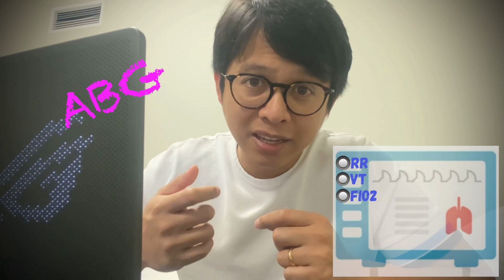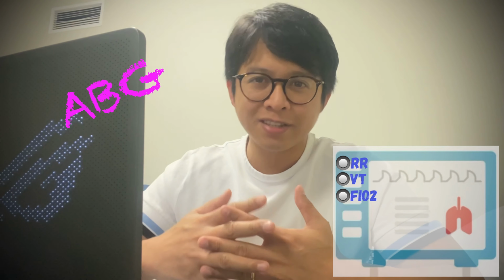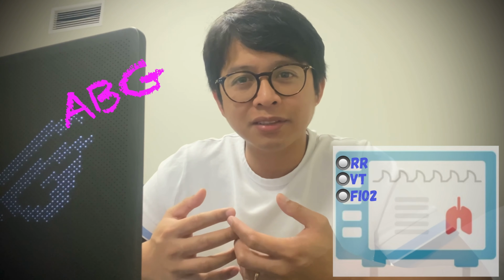We set FiO2 based on how badly patients need it. Therefore, arterial blood gas is needed to determine the oxygen saturation and the partial arterial oxygen of the patient, because you cannot randomly give oxygen to the patient. We need to determine if they need it. High oxygen is toxic. So, did you get it?